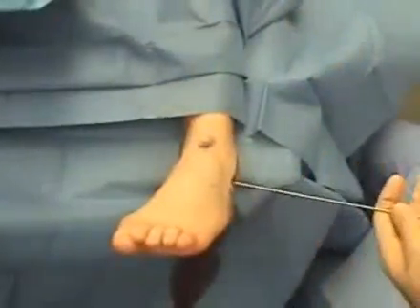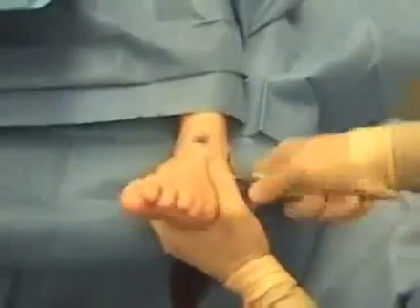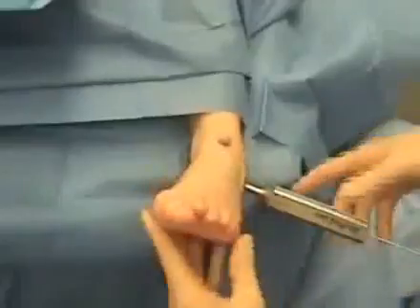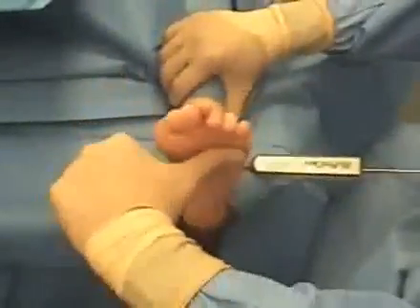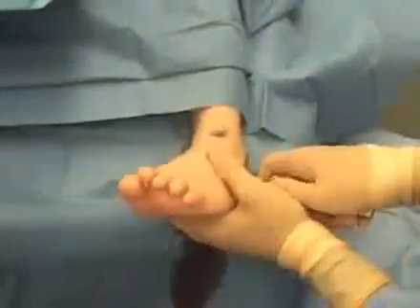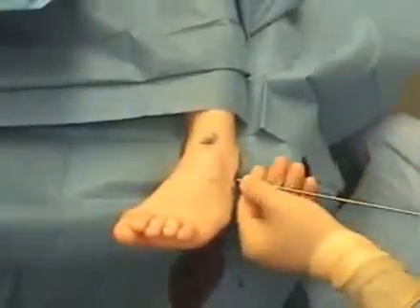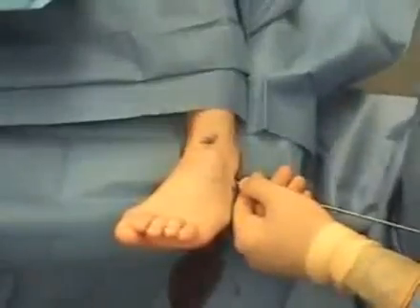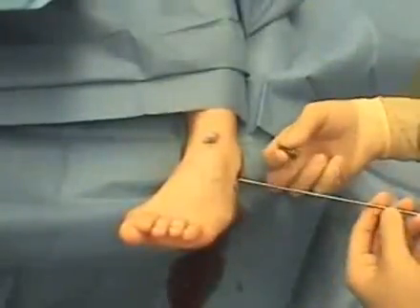If it seems that there's not much of a difference between the 6 or 7, I always feel it's better to downsize than to oversize. So here's number 7, and with this one we still have just a very slight amount of pronation, so we're going to go ahead and use a size 6 stent. So we're going to pull out that trial sizer, and the stent, if you seat it correctly, it's just really hard for that to get displaced.